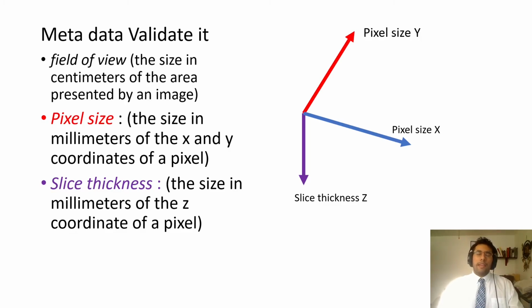So now, to think about pixel data, we need to think about the voxels. On a graph, you have a Y and an X, and that's on JPEGs and PNGs. A JPEG is really just, if you think about it, a bunch of squares in a graph, each square containing a color value. Well, in a 3D space, you're going to have a Z, and that's how thick that slice image is. That gives you a 3D area. And inside this defined area, there could be a tumor in this box, this 3D space, that the model or the program will be looking at.